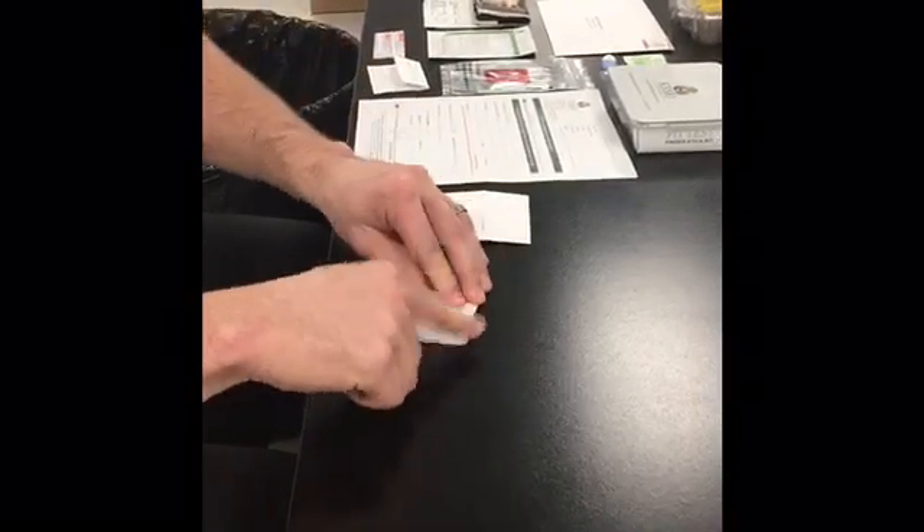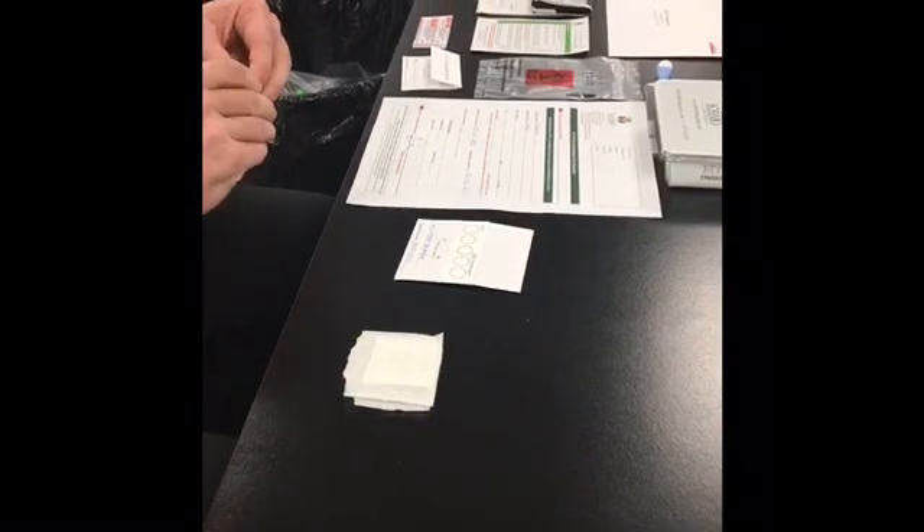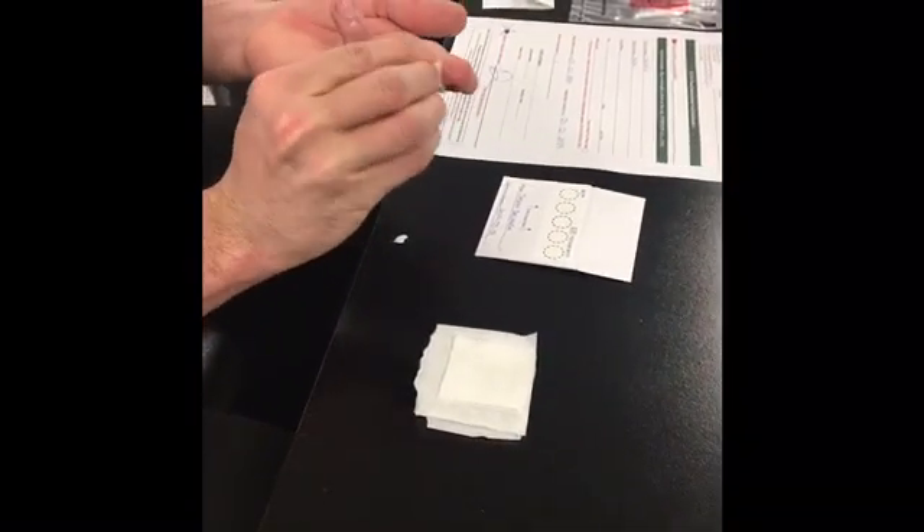Take your blood spot card and place it face up in front of you. Open your gauze and set it aside. Take your alcohol prep pad and clean the tip of the finger selected for testing. We recommend the middle or pointer finger. Allow your finger to air dry.